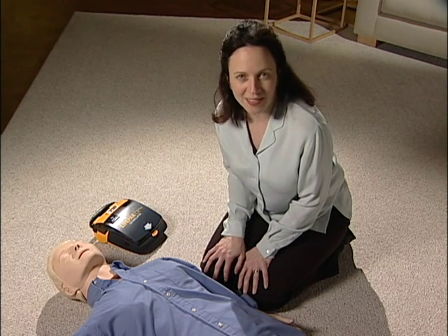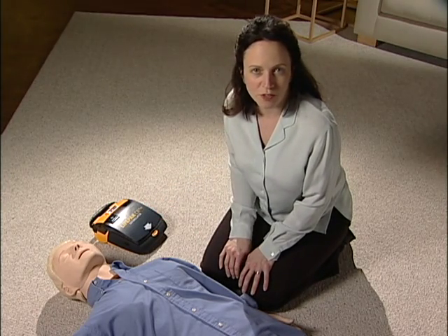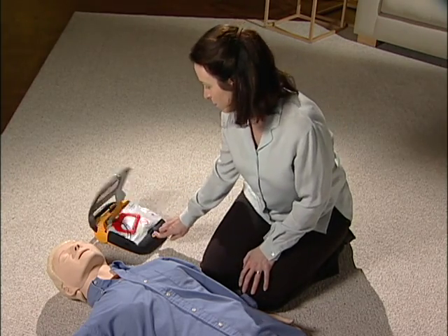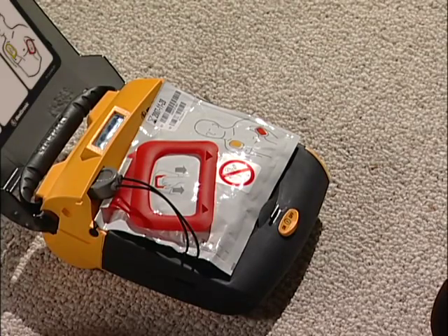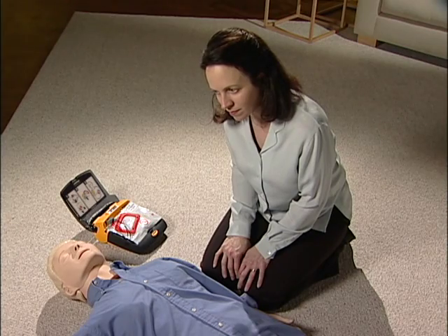Okay, let's go through that in detail. Set the LifePAK AED on the same side of the patient as you. Press the on-off button. Call for help now. Remove all clothing from patient's chest.